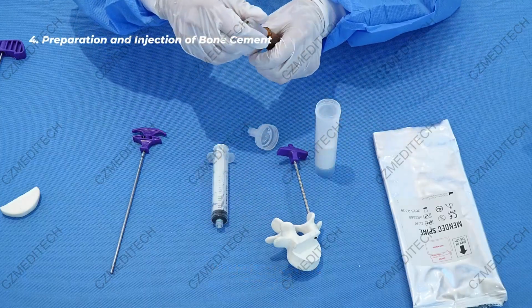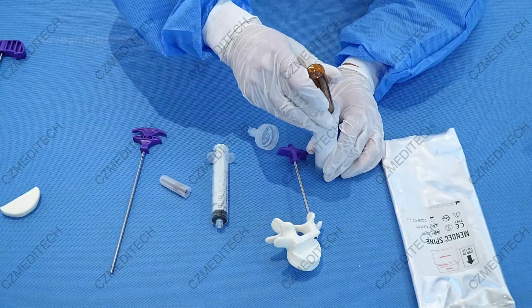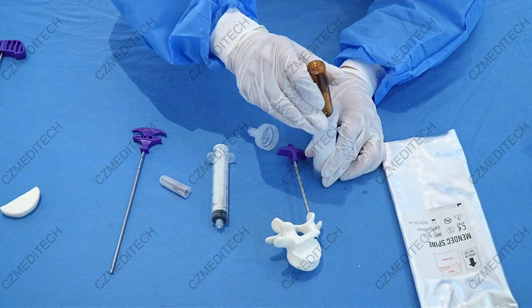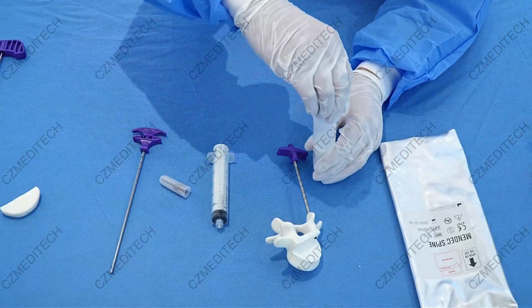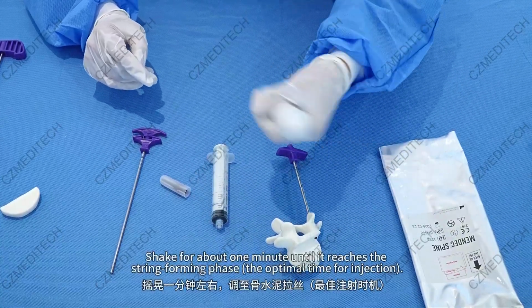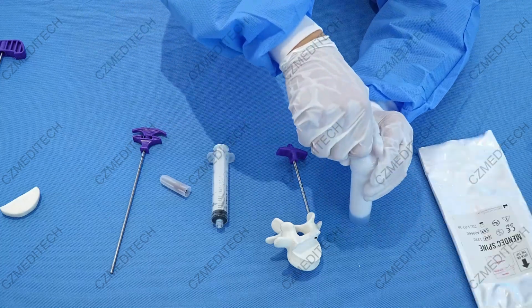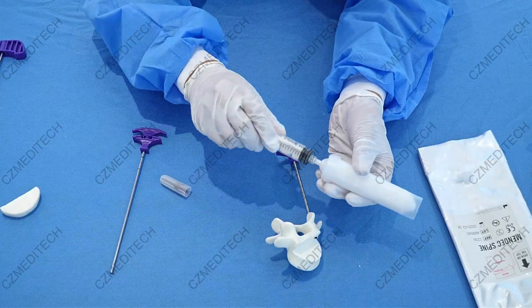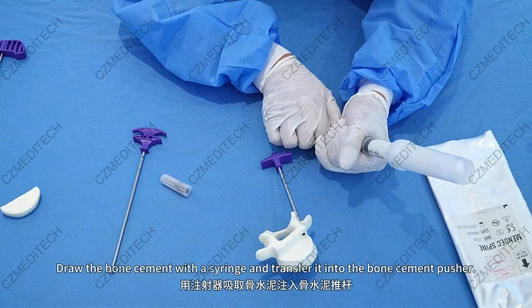Mix the bone cement. Shake for about 1 minute until it reaches the string-forming phase, the optimal time for injection. Draw the bone cement with a syringe and transfer it into the bone cement pusher.